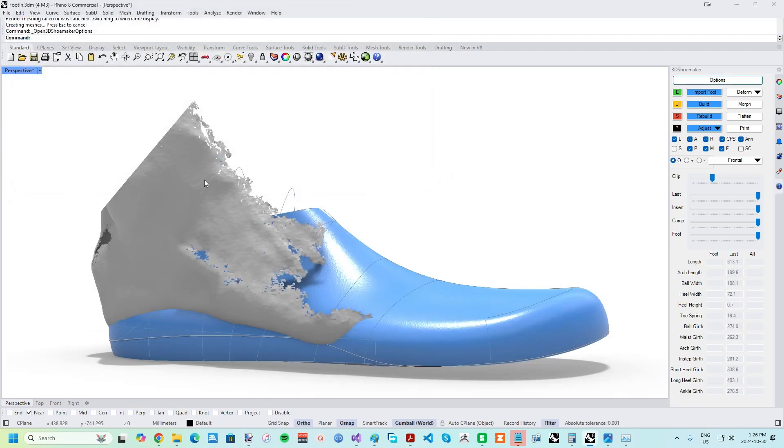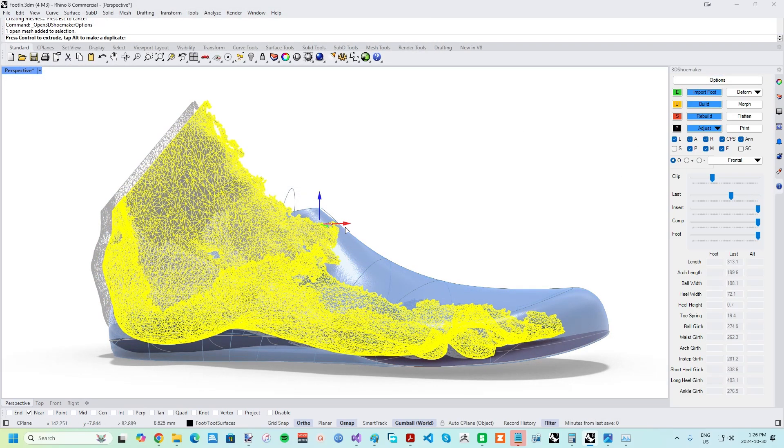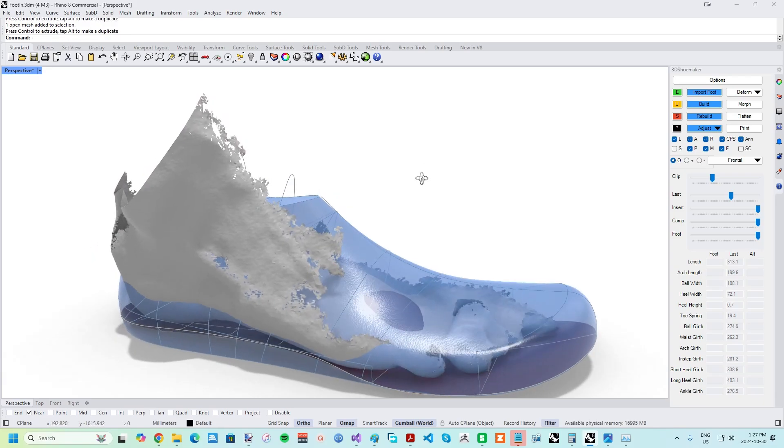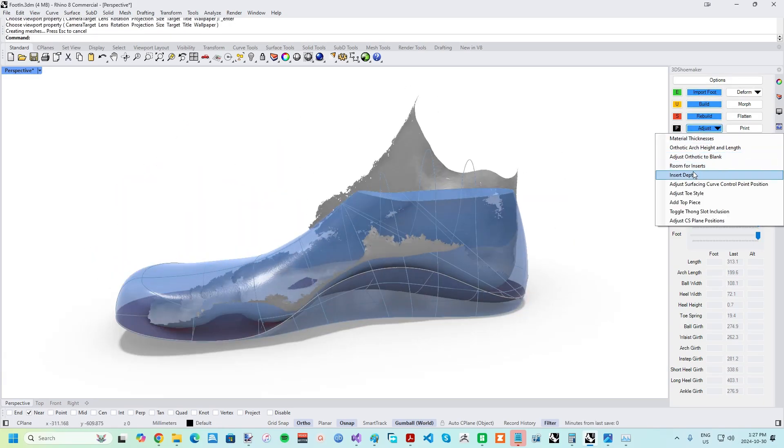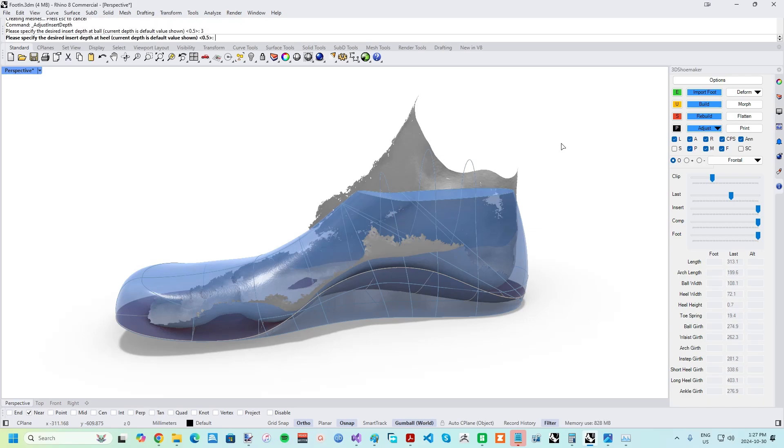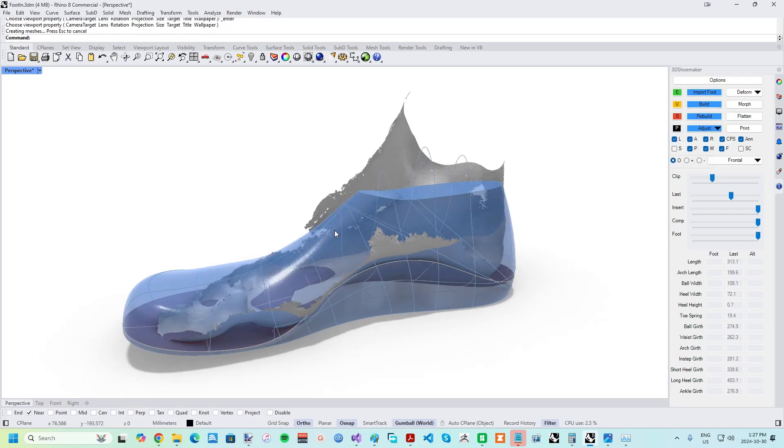Once the build is complete, you may want to turn on manual foot positioning in the Edit tab of the options form to better position the foot in the design. Once satisfied with the position of the foot, press the rebuild button to confirm it.